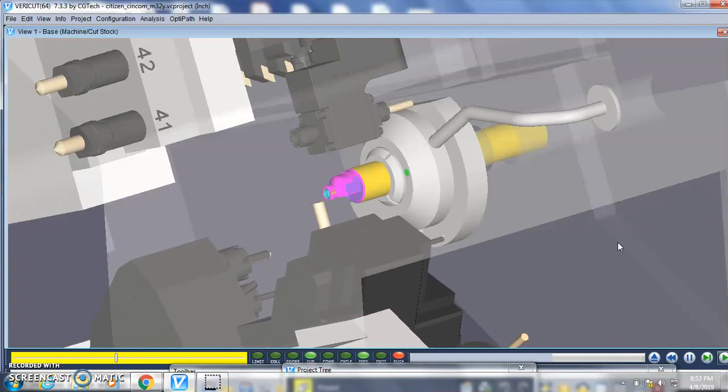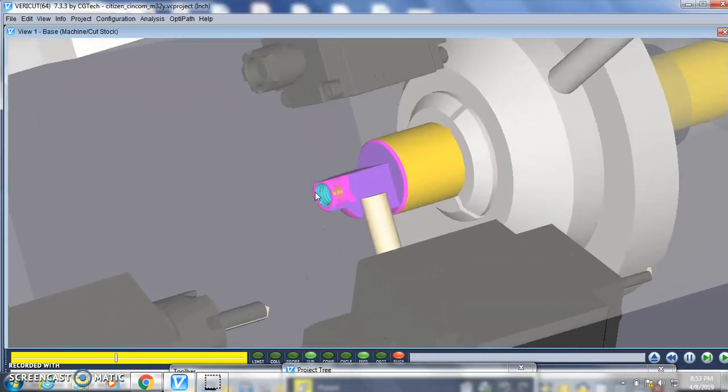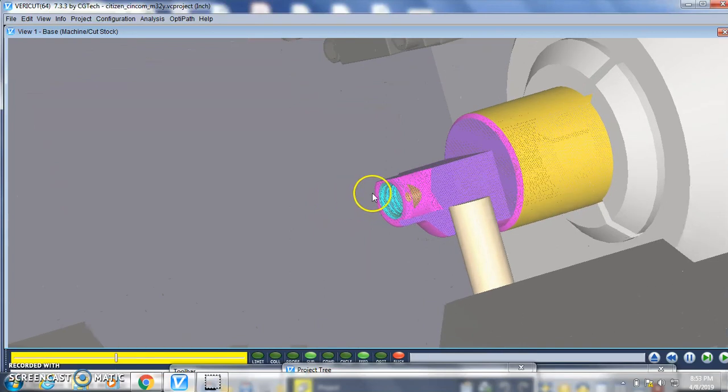The last video I covered was about tapping. Obviously we did some ID thread work on it, a single point ID threading. I'll talk you through step by step how to program single point thread turning, either OD turning or ID thread turning. I'll also talk about thread milling and thread whirling.